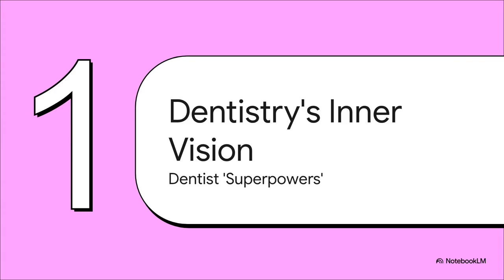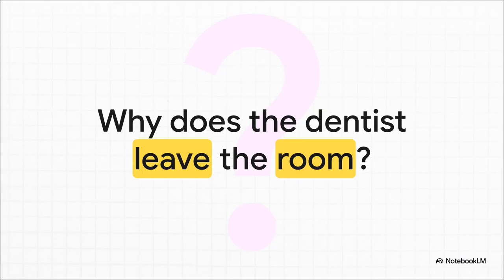All right, first up, why do we even need these images? It turns out what your dentist can see with just their eyes is only a tiny, tiny fraction of the real story of your oral health. And it all comes back to that one question we've all had, right? Why do they step out of the room for something that seems so routine? The answer is all about the power and the historical danger of what that little button unleashes. But first, let's see what that power actually shows us.